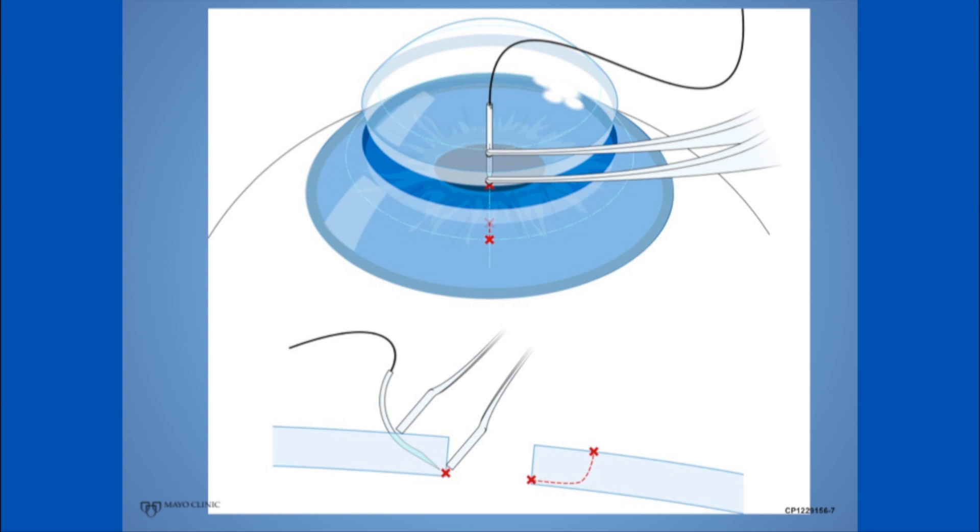we want to position the forceps and the needle so that once aligned, all one has to do is drive the needle along a straight line that begins a fraction of a millimeter in front of the top forceps tip that's positioned at the exact position you want the wound edge to be, and exits the corneal margin just inferior to the other forceps tip, which has been pre-positioned barely above the deepest extent of the graft wound margin.